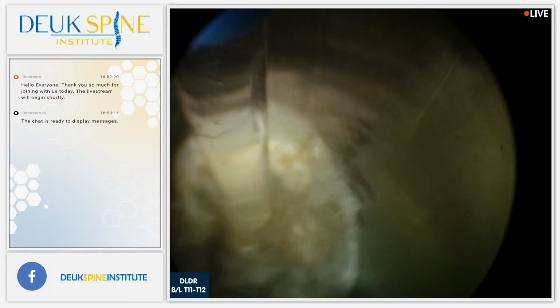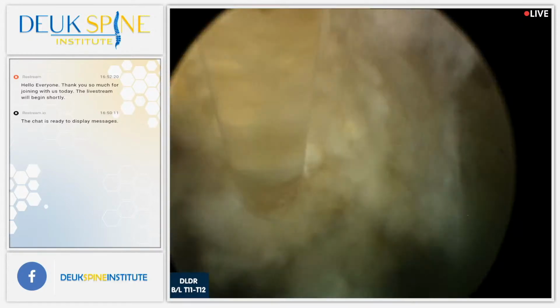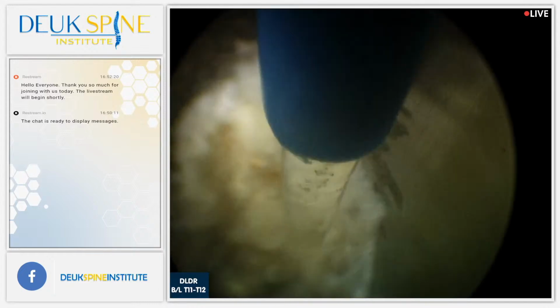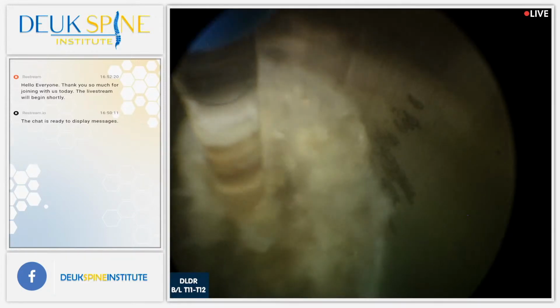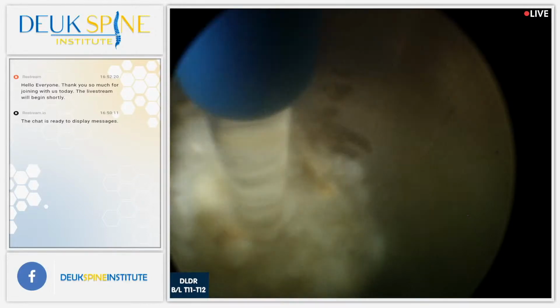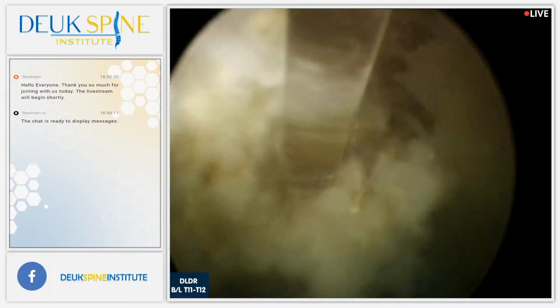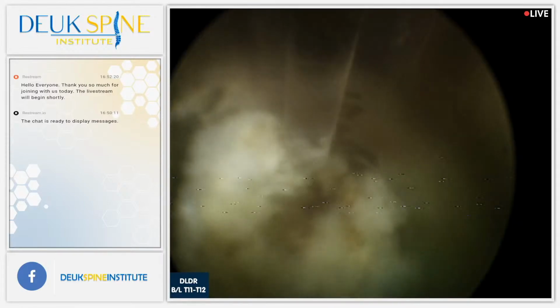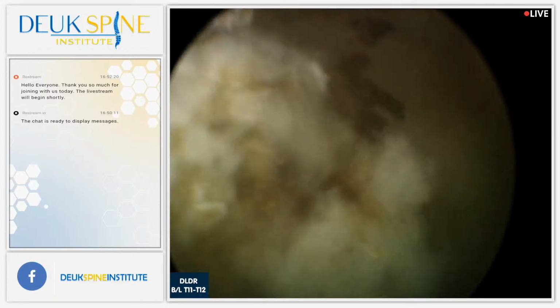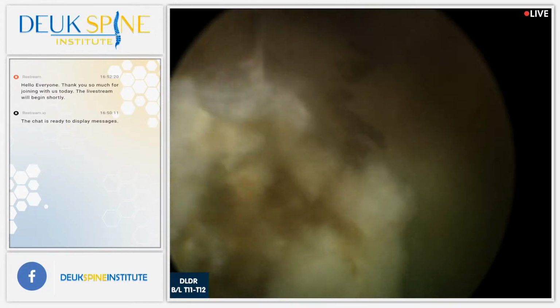By the way, when you remove herniations like this, you're never going to be able to get the whole herniation. Our goal is to get as much as we can, safely. I get people asking me all the time, is the MRI going to show the herniation is gone? No, it's not. The MRI will not show the herniation is completely gone. The MRI is going to show that it's been debulked. It's very, very thick, full of scar tissue. And calcium.